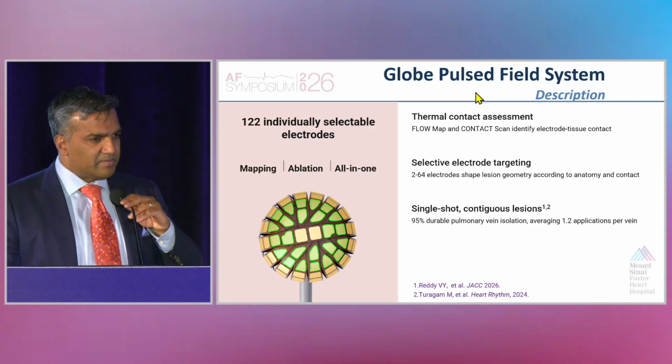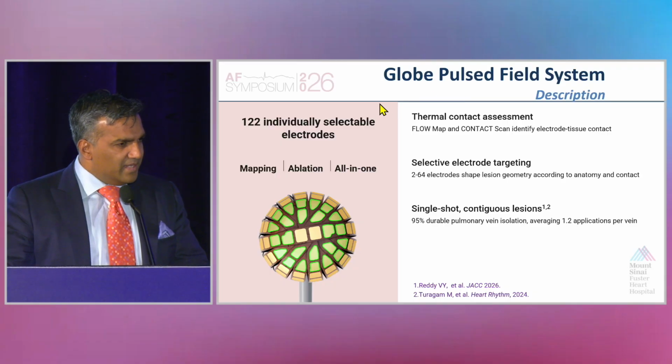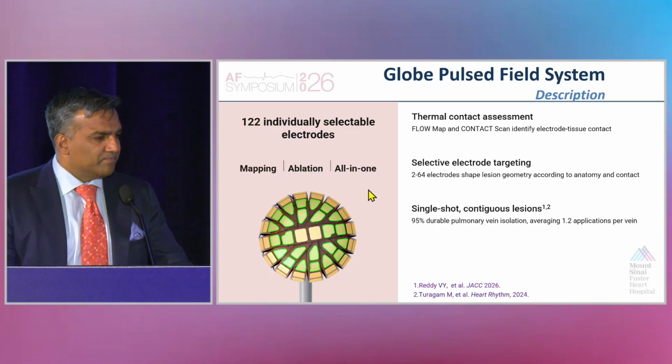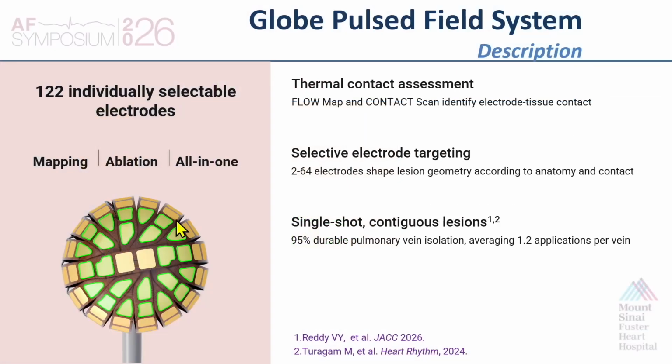I'm going to show a couple of slides, and I think it's worth describing since this is potentially quite practical for some. The device itself is, as you'll see, a multi-electrode spherical array. There's a total of 122 individually selectable electrodes, and you see each of them here. It has the ability to detect contact, and it uses two different types of scans, and we'll show you that. You can individually select the electrodes for targeting, so you identify which electrodes are touching tissue. You select which ones you want to deliver energy from, and then you deliver the energy.